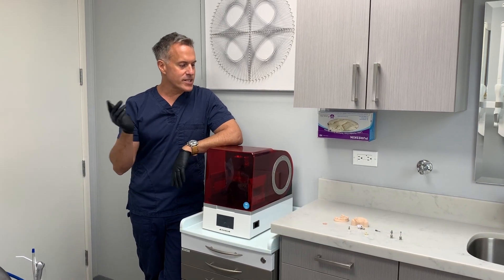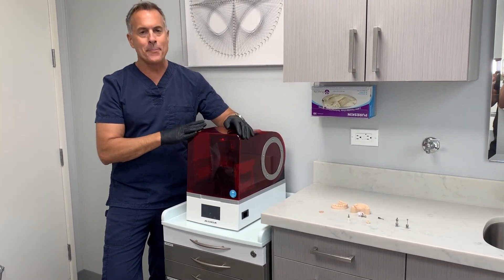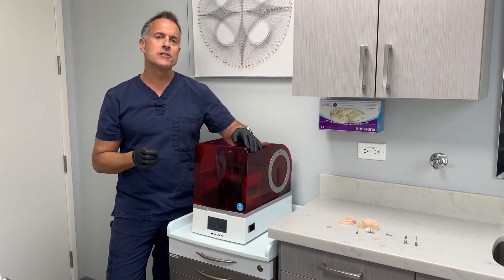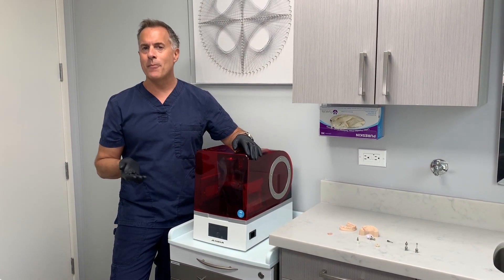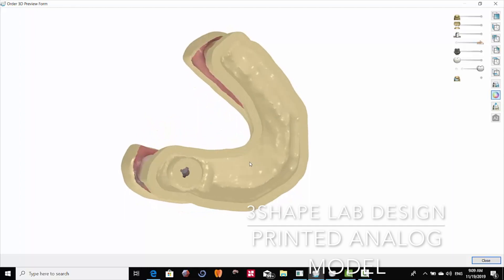Just a little bit about the Asiga Max: since this cures at 385 nanometers, it has the ability to cure different types of materials. And the material we're going to be using is a gingival mask material. It's made out of rubber, so it's no different than the polyvinyl stuff your lab probably uses.